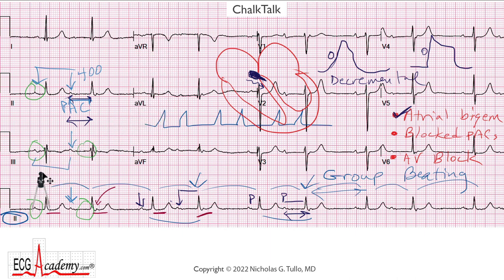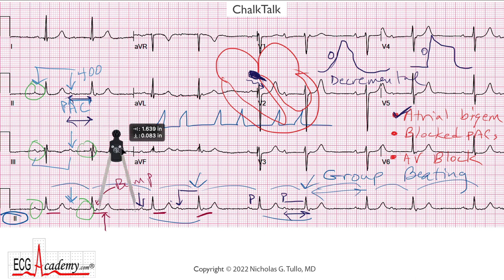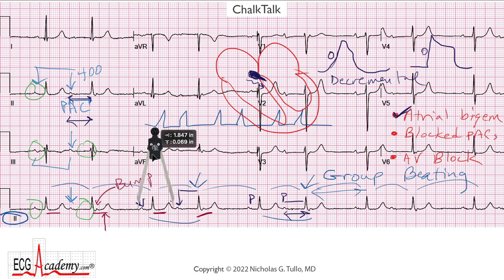Let's set our calipers to the P-to-P interval — looking for the beginning of the P wave, then moving the calipers over to see if that P wave occurs on time. The P wave should have occurred right where the caliper point lands, so what is this bump here? Let's keep measuring and see how things map out. Bringing the calipers over to where we expected the P wave, we see that this one does occur on time, and if we move to the next one, we see that the second P wave is similarly spaced.